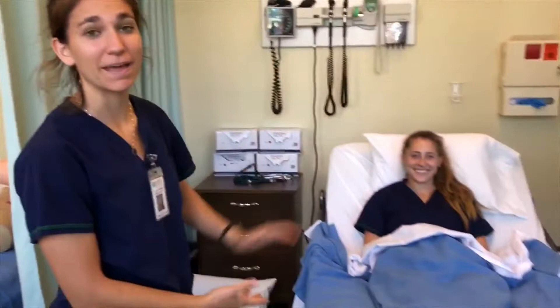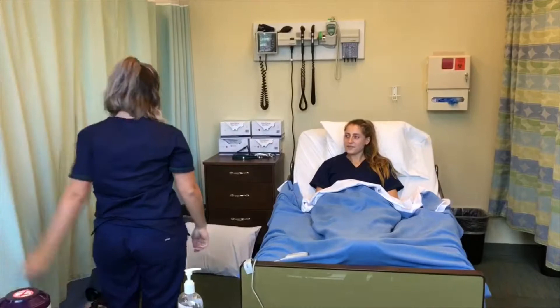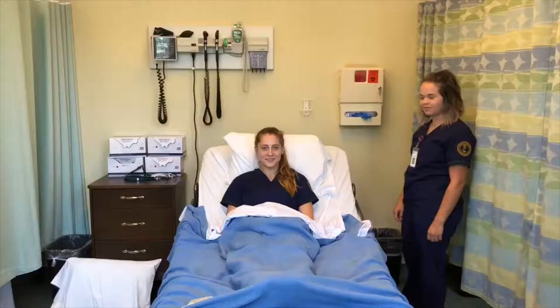Sophie is a patient at Georgia College Skills Lab who needs a Foley catheter. Madison is the nurse who will insert the Foley catheter, requiring sterile gloving. She will be putting in a Foley catheter using sterile technique. Nurse Madison will show us how to put on sterile gloves.